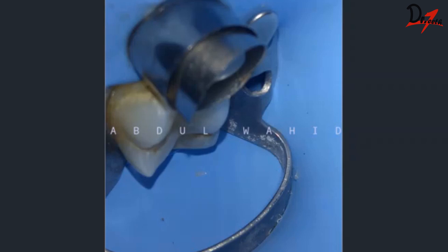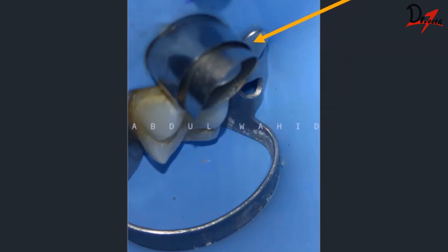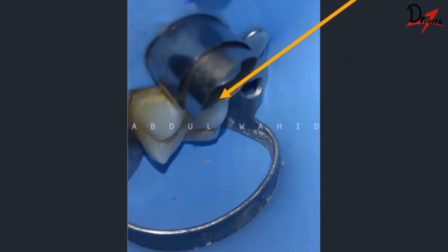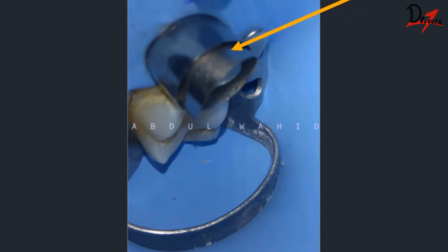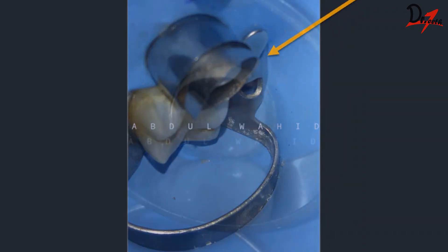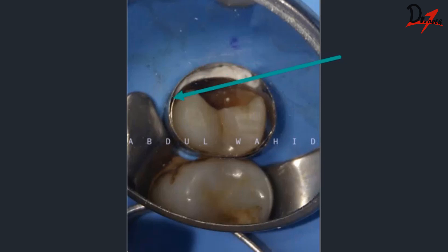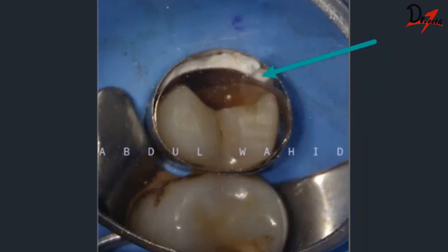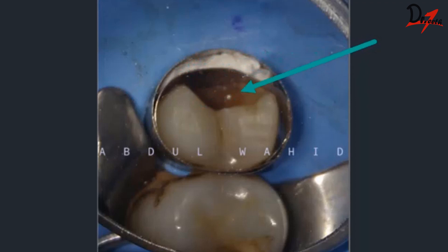Now, the adjacent tooth was missing or grossly decayed, so we did not have a classical presentation where we use a wedge and matrix. We cannot place a wedge because the adjacent tooth is absent. We have options: use a regular Tofflemire matrix, or use a matrix-in-matrix technique. Here, the outer matrix is engaged at the contact point on the distal side, the inner matrix is placed to adapt to the tooth margin, and Teflon is stuffed between the two matrices to give a proper tight adaptation at the proximal site.